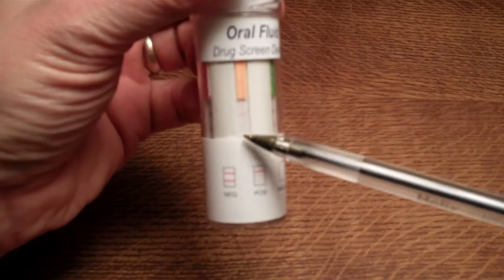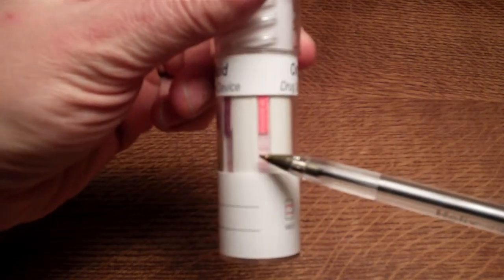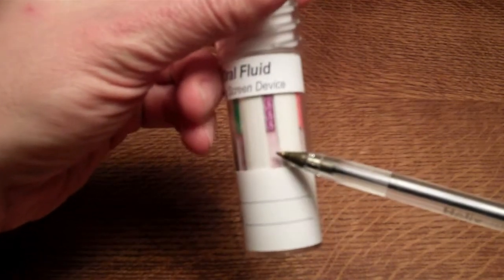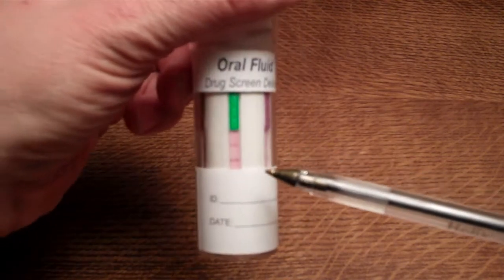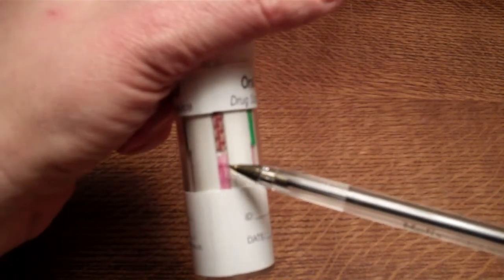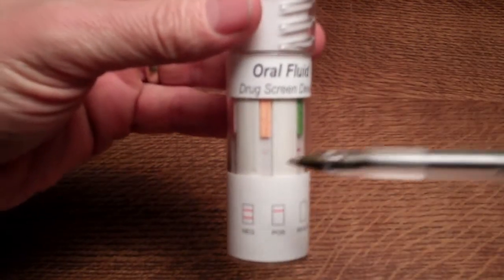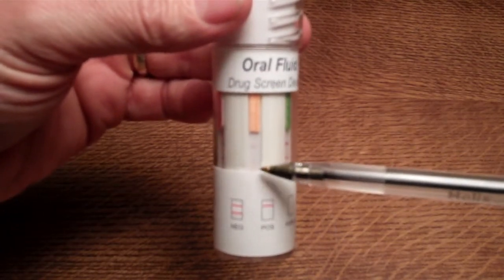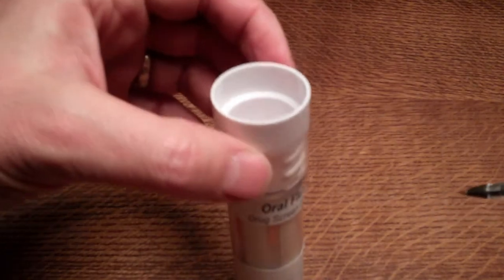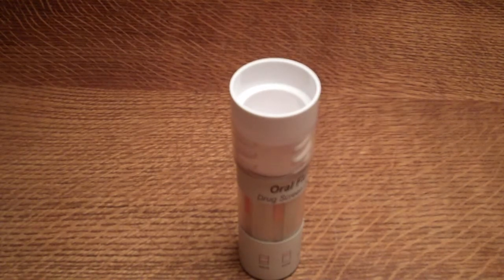Compare that to the BZO test membrane, which is taking a lot longer to develop, although there is a clear control line. The methadone test is showing a clear negative already. The OPI test still has a lot of dye in the background but clearly shows a control and test line. The COC and THC membranes also show clear control and test lines. The one we're still waiting on is the benzodiazepine result — we're just starting to see a faint test line for a negative result, but we need to allow a full 10 minutes before interpreting a positive, which is shown by the absence of a test line in the presence of a control line.